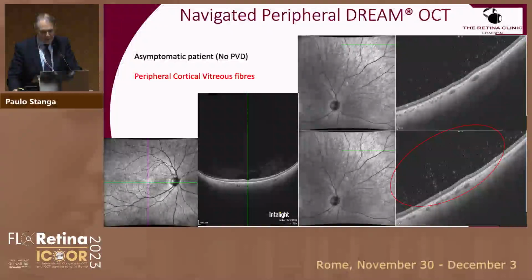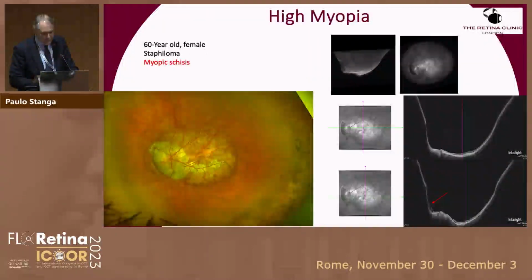So how helpful is this on an everyday basis? Here you can see an eye, and you can see a nice bursa premacularis. You can see that the vitreous is clearly attached, and you can see the system of cisterns, but we can also see that the vitreous is attached peripherally, and you can see the increased content of collagen fibers in the peripheral vitreous cortex. This is a 3D rendering.